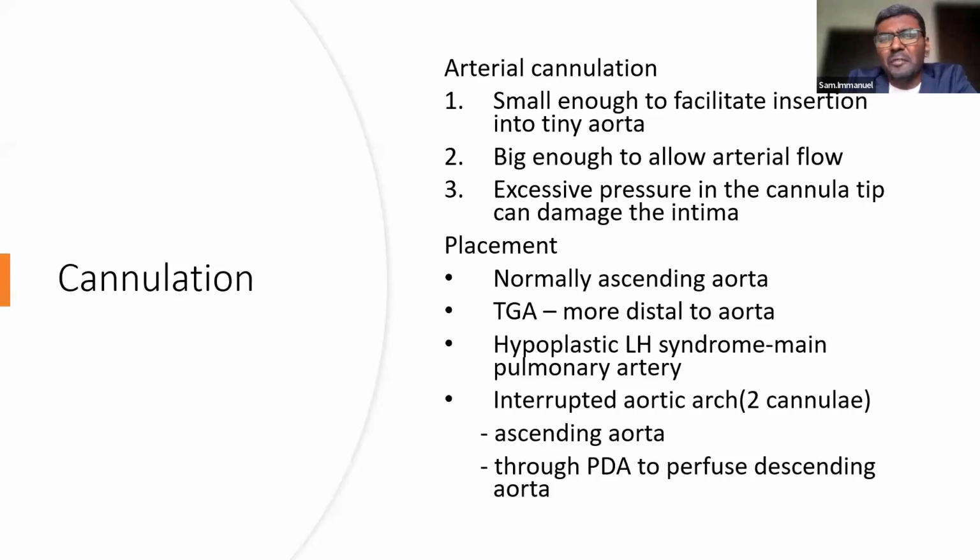There are a lot of techniques where you will have a PDA connecting your aorta and your pulmonary artery. Without snugging, it is going to cause recirculation, and you can even cannulate the PDA to go on pump before ligating, or you can ligate and then go. All such updates are available for discussion.